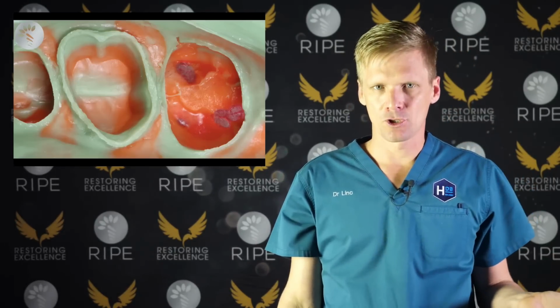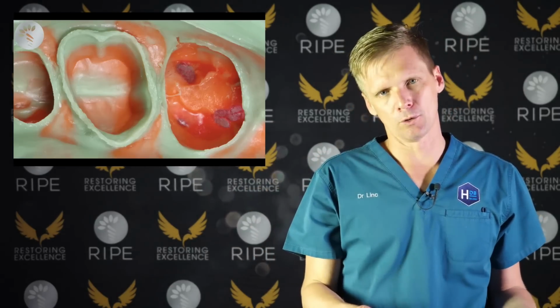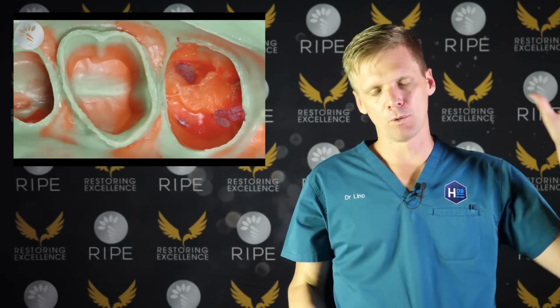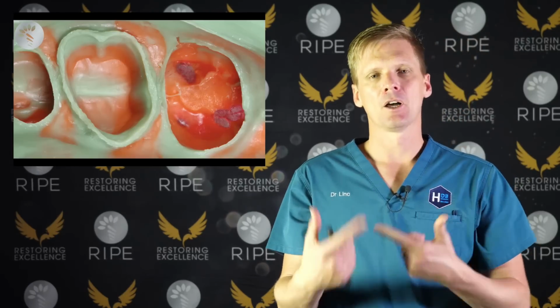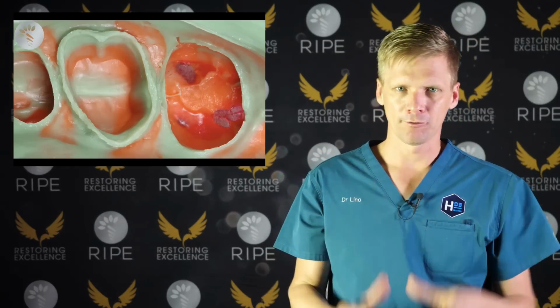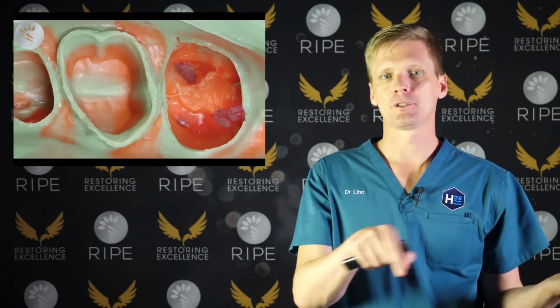Generally the assistant should be filling the tray before you start pulling the cord if it's a single tooth, because you want the tray going in as soon as you finish injecting. If you inject light body and the warmth of the mouth starts heating it up, the light body can start to set and then it won't flow properly. So you want to have the tray half filled before you start putting light body around the tooth.